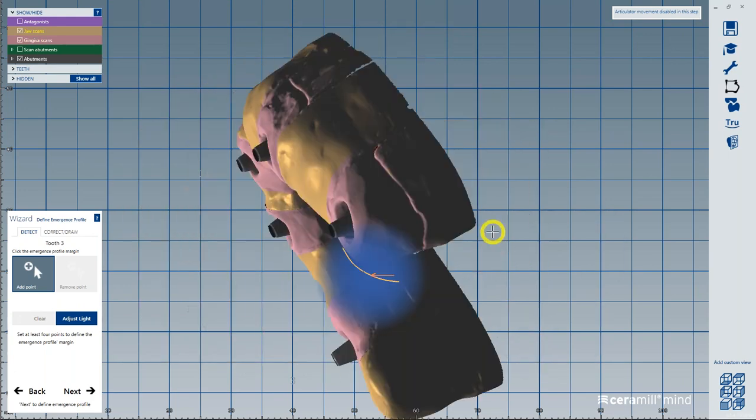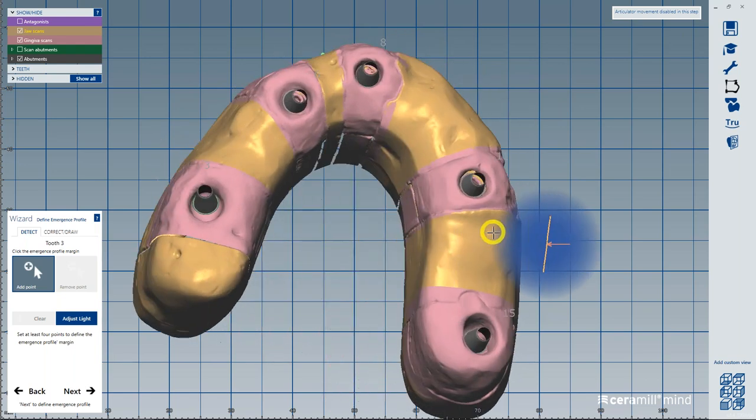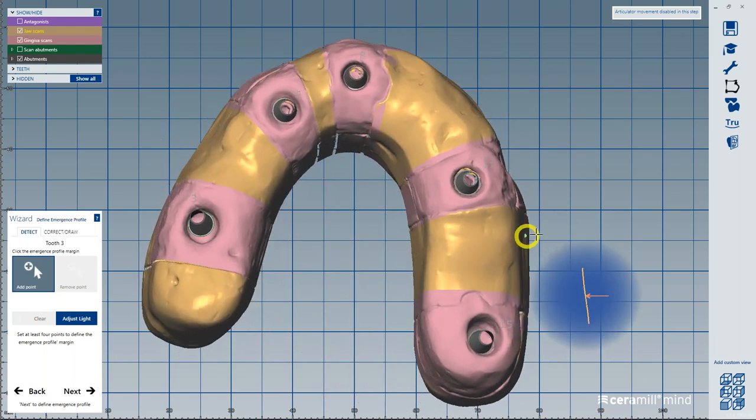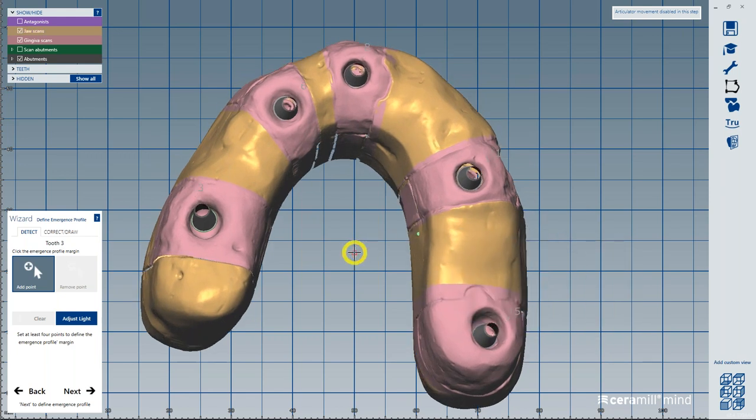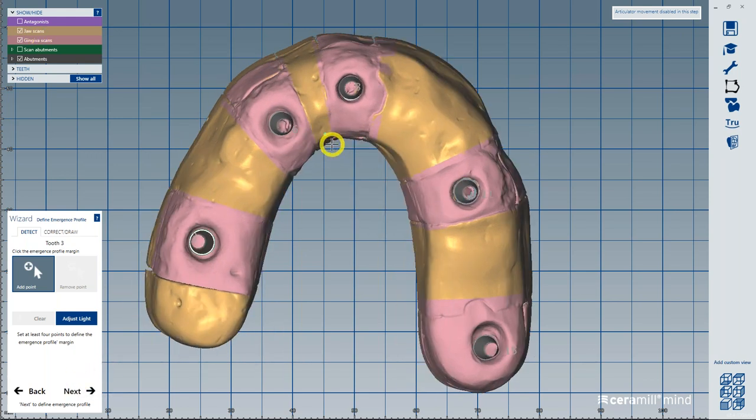Now we can mark the emergence profile. There's two trains of thought on that. Some designers don't mark this and they skip ahead. Some want this defined and they want that pressure against that tissue. Others do not want that. It's a personal preference thing.